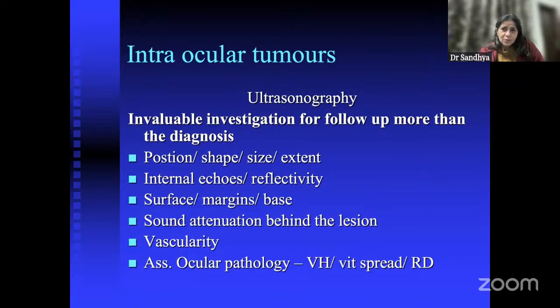Now we have diagnosed that the patient has some intraocular tumor. We are giving whatever treatment we are doing, and we want to know whether the lesion is increasing or decreasing, and what is happening in the middle of the lesion, how it is behaving. Ultrasound is the only way we can know what is happening within the lesion, outside the lesion, the size and everything. So it is very important for follow-up rather than diagnosis.